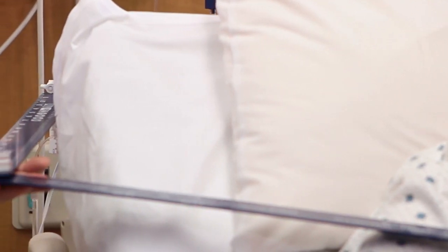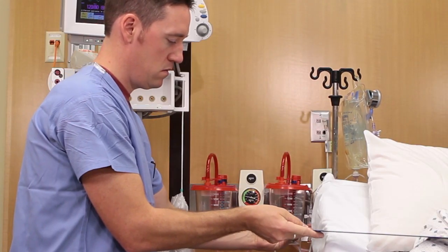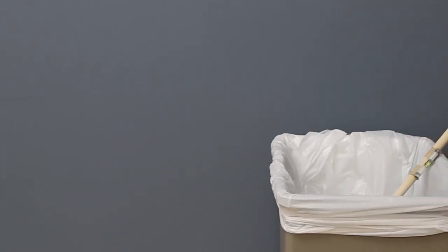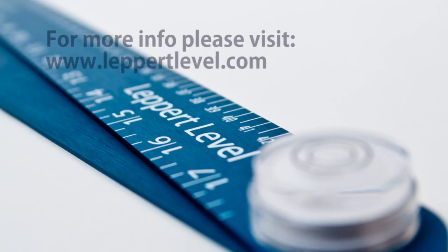With much needed refinement, the stick of yesterday has become the level of today. Don't leave your patient's care to depend on the dirty old stick. Get accurate data to trend with the Leppert Level and you will never have to explain to another patient or family member why there is a dirty old stick hanging in their room.